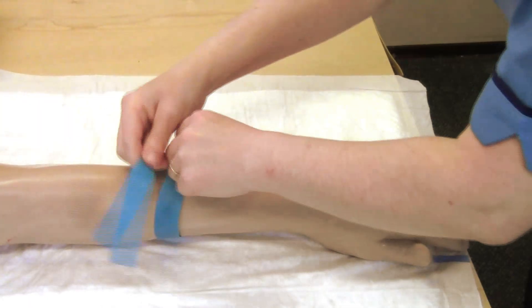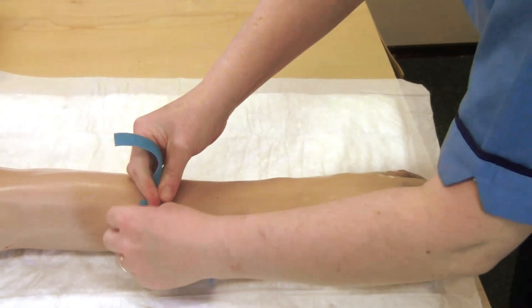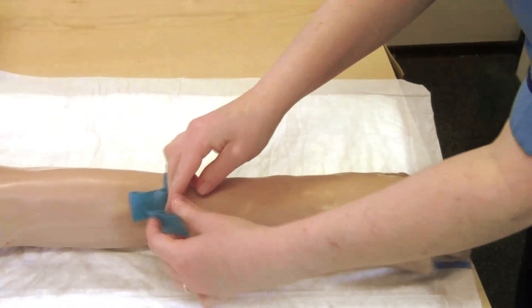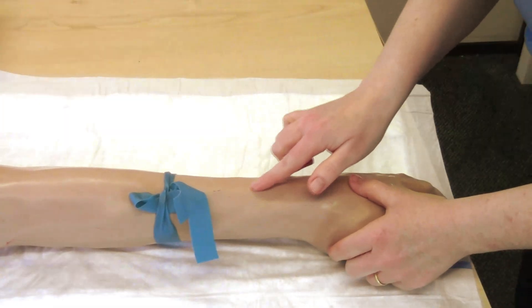A tourniquet and a sharps container. Apply tourniquet for no longer than 2 minutes. Select appropriate vein and then release the tourniquet.